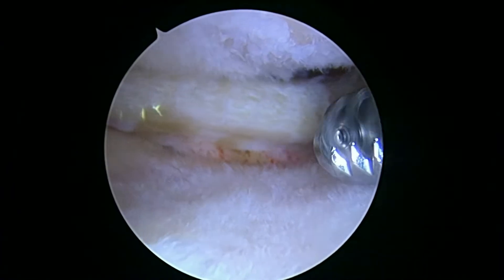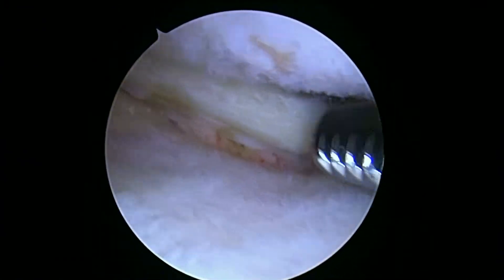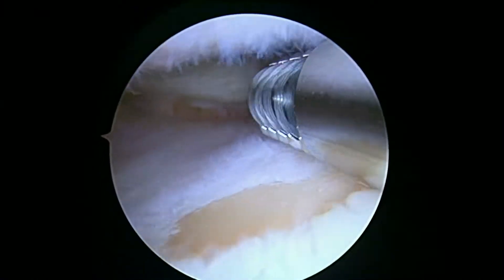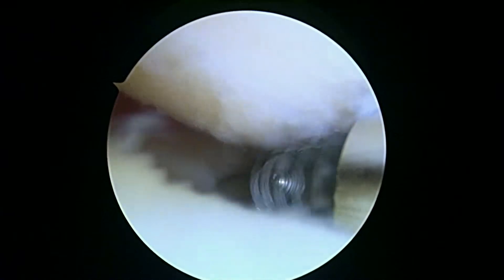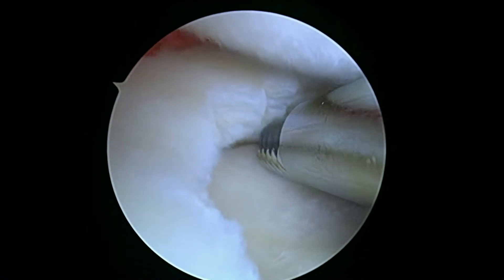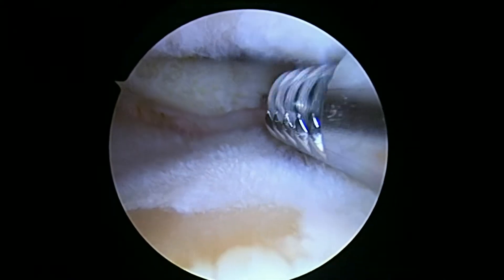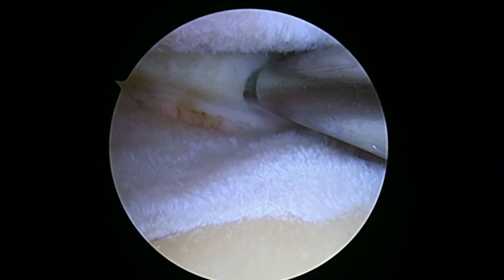So we've trimmed back as little meniscus as possible, but we still had to take a fair amount of the posterior horn out in order to get you back to a stable meniscus. That looks better. You can see you've got areas on the tibial plateau here where it's yellow, where you've lost all the cartilage. The femoral condyle on this lateral side is not so smooth either. All in all, I think we've done the best we can here today, and hopefully our bone marrow concentrate injection will get you some relief also. But at least that meniscus shouldn't really bother you like it was.